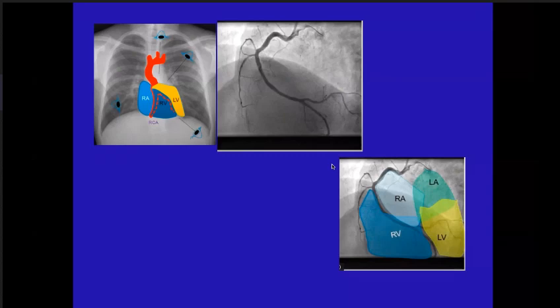Spine is here. Can you see the spine? The heart is still overlapping the spine. Steep LAO, because most of the heart is in front, and even the left posterolateral branch is in front of the spine. Therefore, it must be a very steep LAO. But it's still overlapping the heart and the spine, therefore it's not true lateral. Steep LAO and cranial. Cranial. Diaphragm is seen.